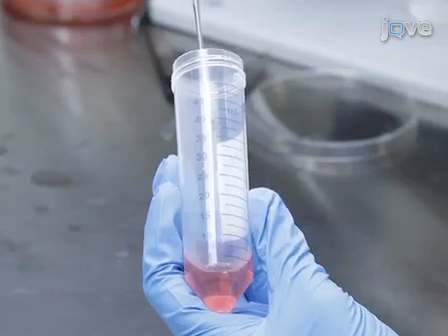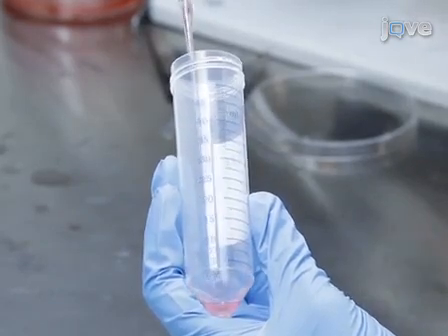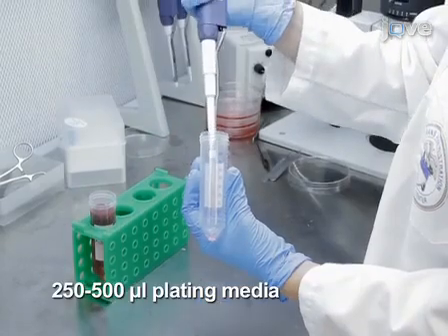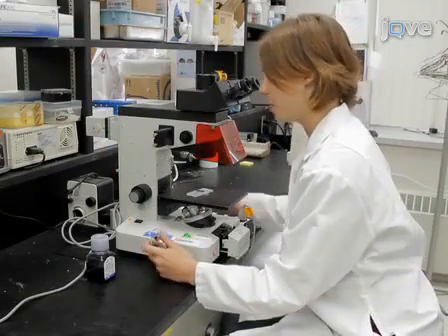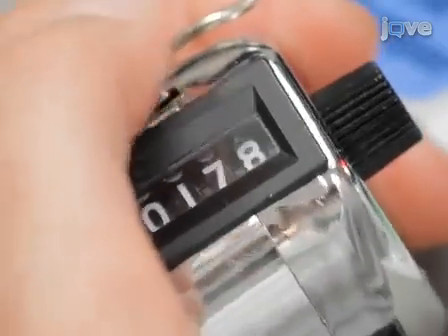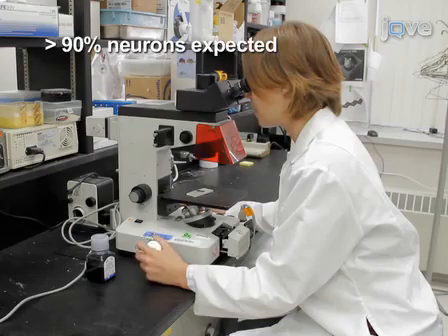Remove the supernatant. The pellet is rarely visible to the eye at this stage. Resuspend the cells in a small amount of plating media. Count the cells using trypan blue exclusion to identify live cells. The cells are now ready for plating. A purity of greater than 90% neurons is expected.